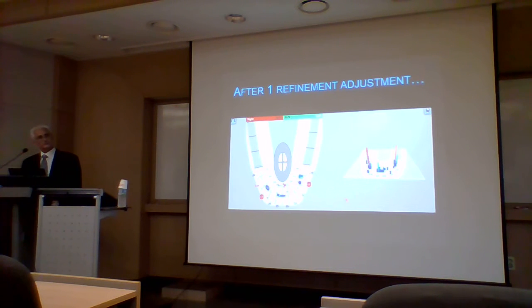During this series of examination, you don't touch any sensitivity. That's a good question. Once you set the sensitivity correctly and you're going to adjust, you leave it where it is so that as you lower forces, it becomes visible. Right? If you change the sensitivity, you'll affect that reduction in forces.